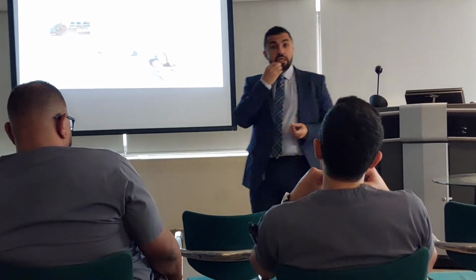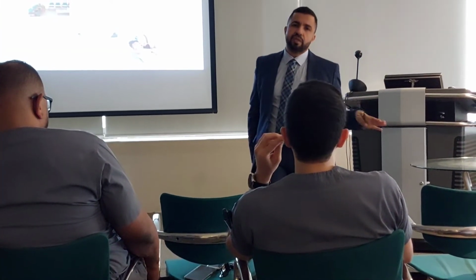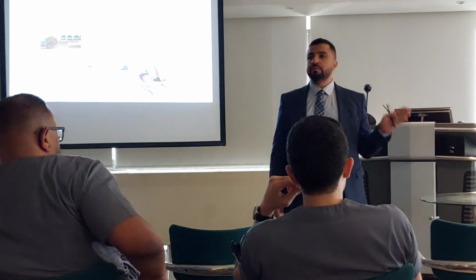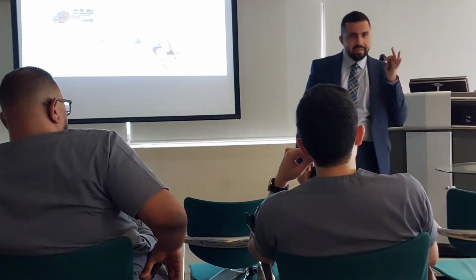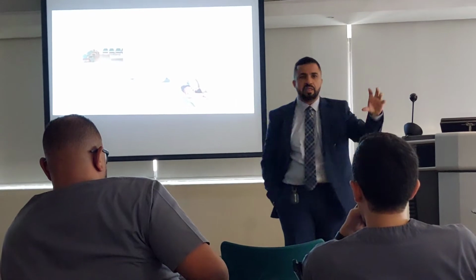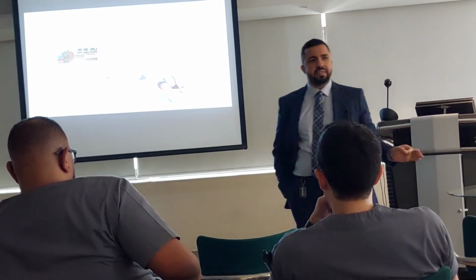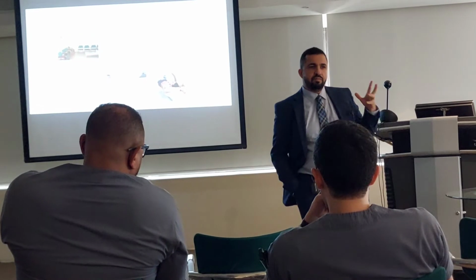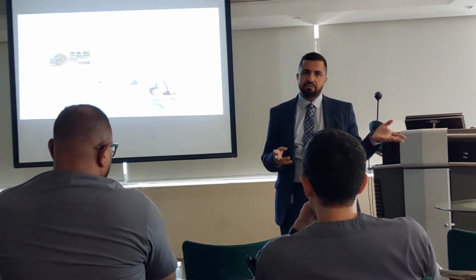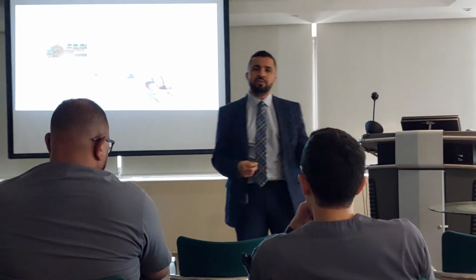You should have written instructions on paper, and you should make sure he gets them right. Either your receptionist is well educated, or you yourself invest some time. This is quality. Discuss this with him. Go sit with him and explain: I need this, I'm doing this because of this. I need him holding his breath, ECG, heart rate. I will give him a beta blocker orally because that does this for me. The patient, and the doctor as well, will be convinced why. An informed patient is a cooperative patient. That's how it works.